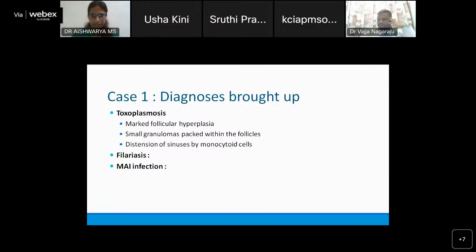Yes, ma'am. This could be one of them. How would you defend yourself? Ma'am, this could actually be one of the potentials, since the granulomas seen in atypical mycobacterium are of the non-caseating type. So that could be one of the reasons. And there were a few Langhans type of giant cells, but the granulomas are well formed in this case, ma'am. Whereas in atypical mycobacterium, there would be more ill-formed granulomas.